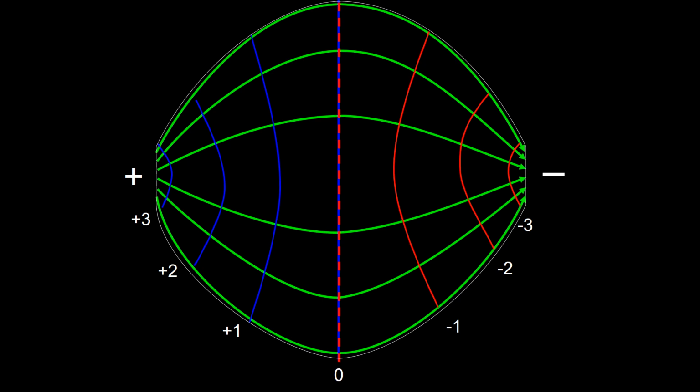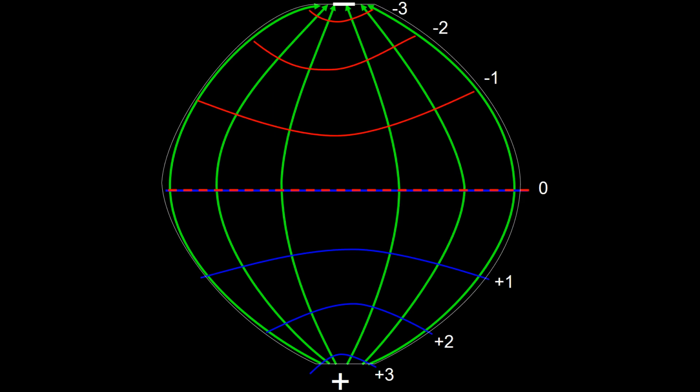But in reality, in the body, we only have three-dimensional conductors. Thus, when we talk about conductors in neurology, we always talk about volume conductors because there are 3 dimensions to it. Now I am going to take this figure and turn it. This turn in position will alter the direction of all its components, but not their relation, as you can see in this frame. In this frame, as you can see, I have turned the figure upside down and the negative end goes up while the positive end goes to the bottom.